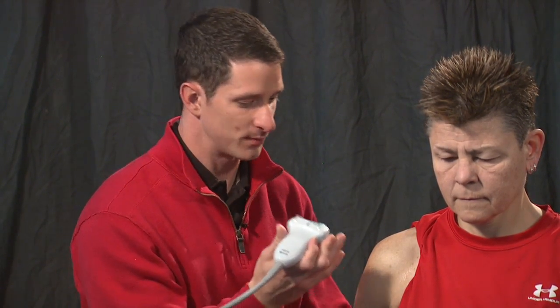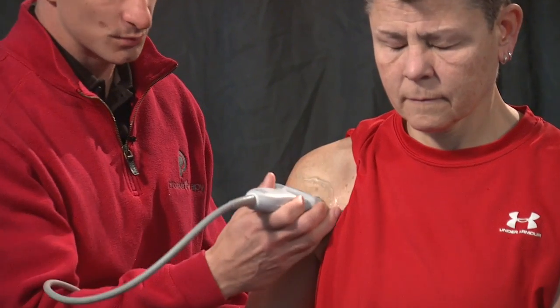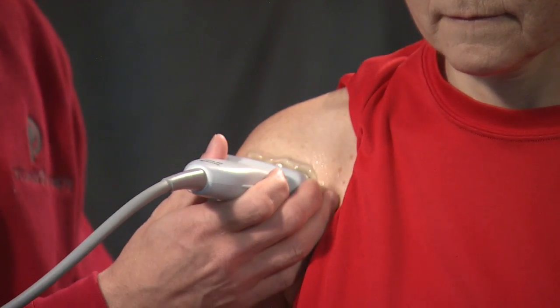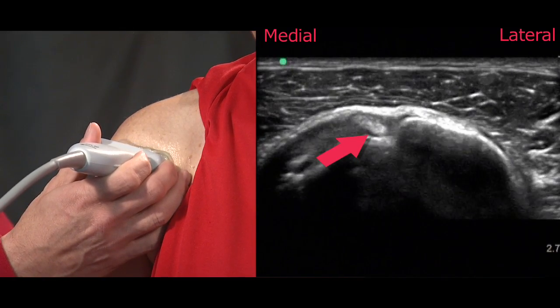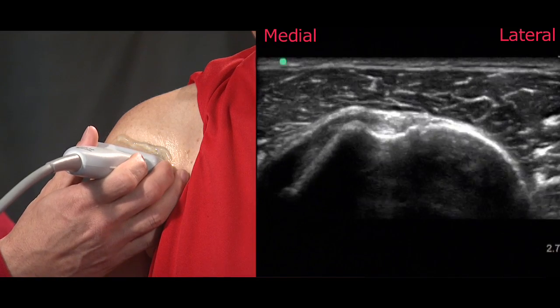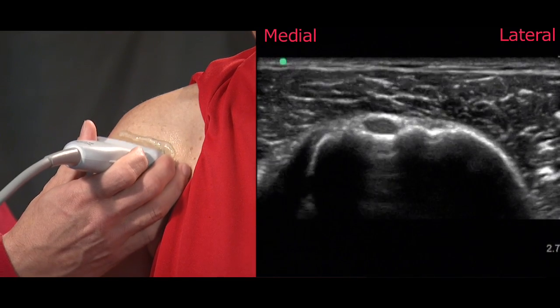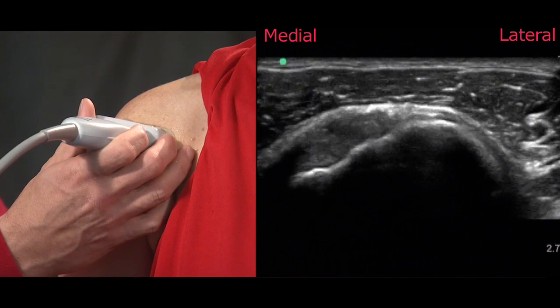We'll start off with the assessment of the biceps in the short axis by placing the probe at the superior margin or at the superior portion of the humeral diaphysis. In this position you can see the biceps groove, and by sliding the probe superiorly and inferiorly you try to optimize the depth of the groove to fully assess the short axis of the biceps tendon. Here you can see as we slide superiorly and inferiorly the intra-articular portion of the biceps as it leaves the groove.